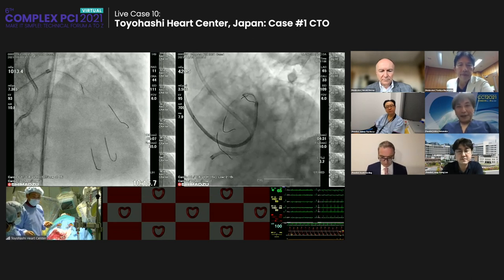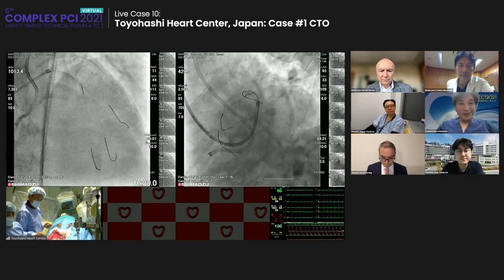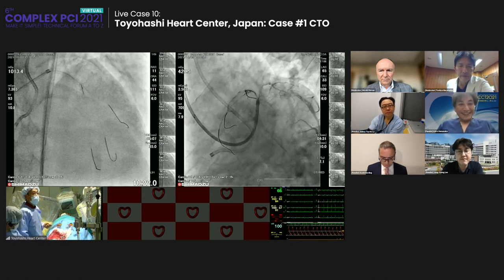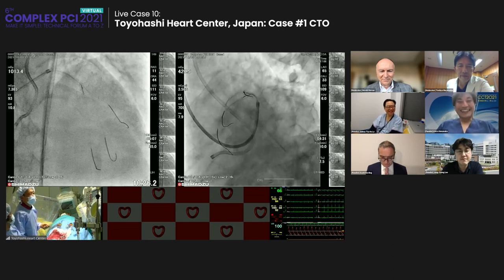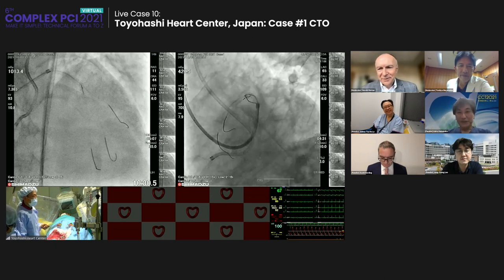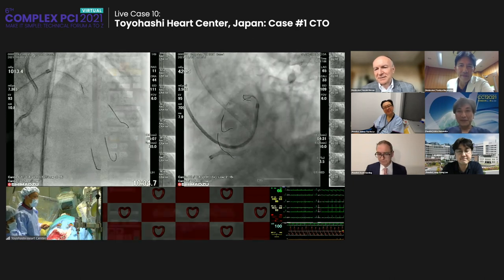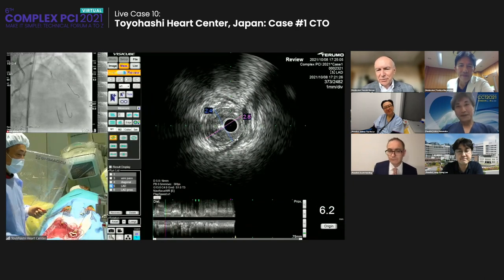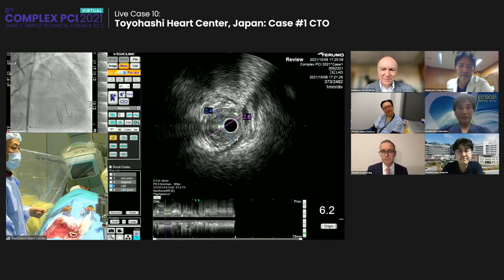I guess Nas sensei has another option using the DCA on the ostium of the LAD. Yeah, no. Today I use the 7 French. But I don't think the plaque is massive inside or not compressible when you have an in-stent restenosis. It's rather soft tissue there.